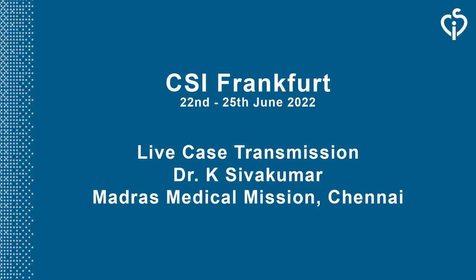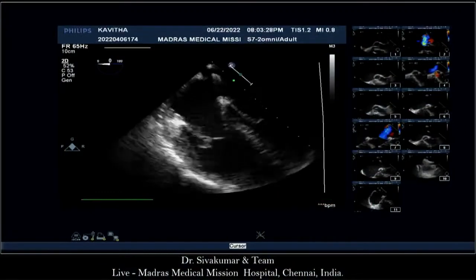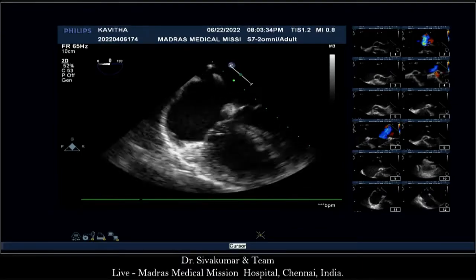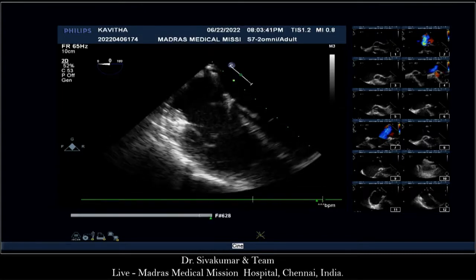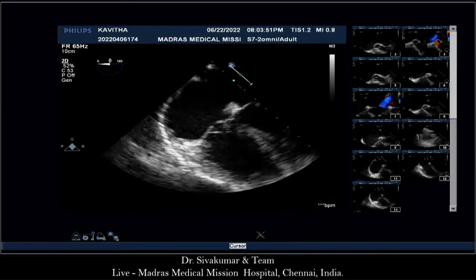Shaq, I would like to show the transesophageal echo live. Can you make the echo big? For a change, this is a large ASD. So, Srija, you can start showing the echo images live. Around 29 I got. Sorry, 31. Till now, maximum dimension.